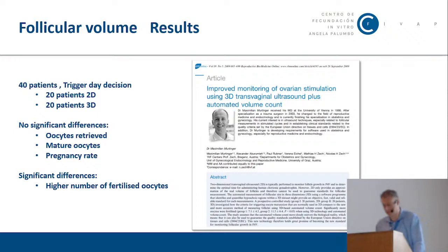It is true that the randomized controlled studies published so far do not show superiority of 3D over 2D, but we believe that part of the problem is that in all these studies, diameter and not volume was used to decide the day of trigger.